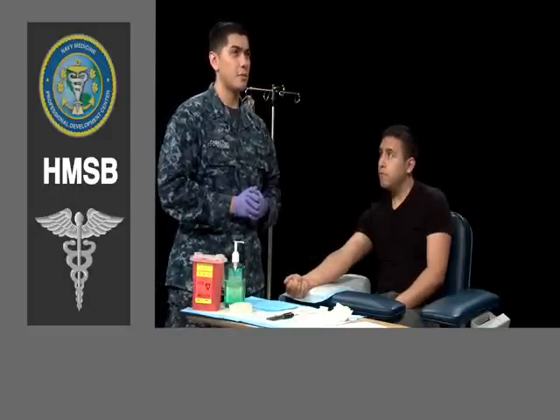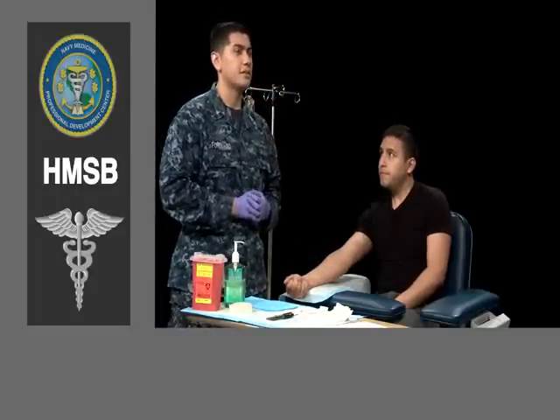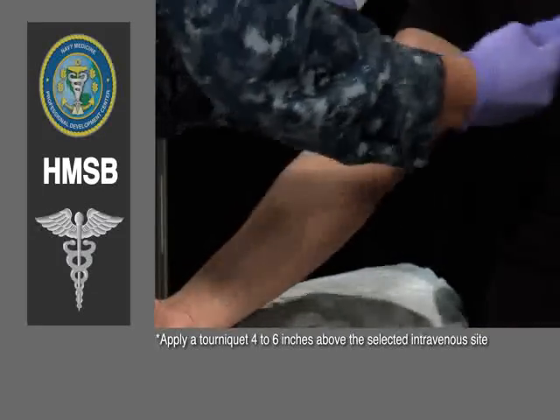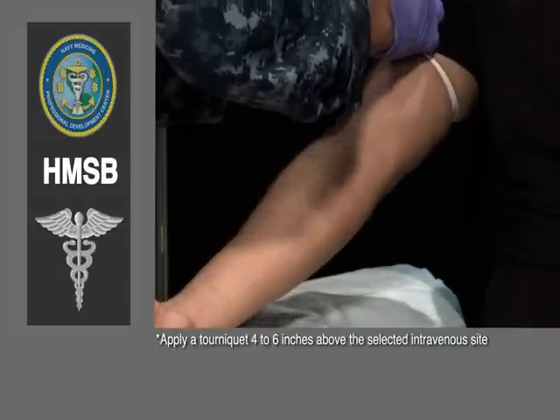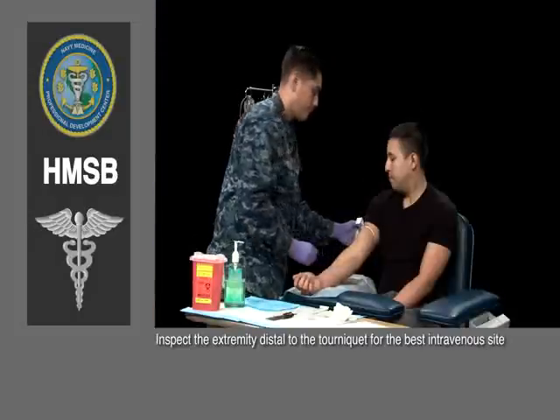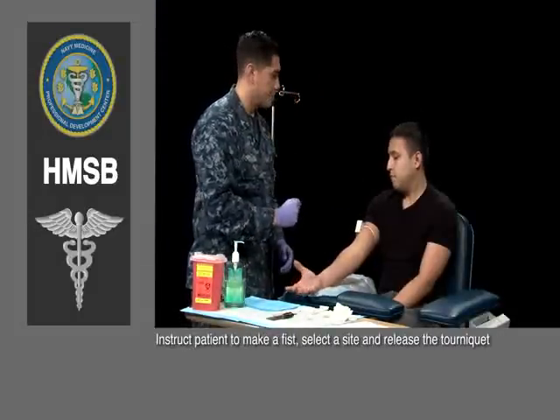After placing the absorbent pad under the patient's arm, I'll attach the tourniquet 4 to 6 inches above the selected site. Sir, can you make a fist for me?